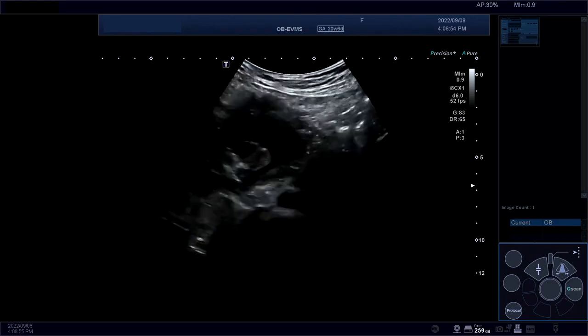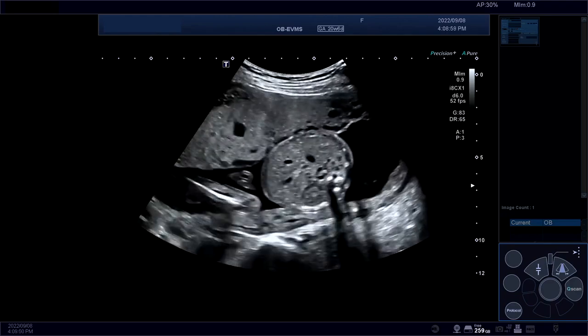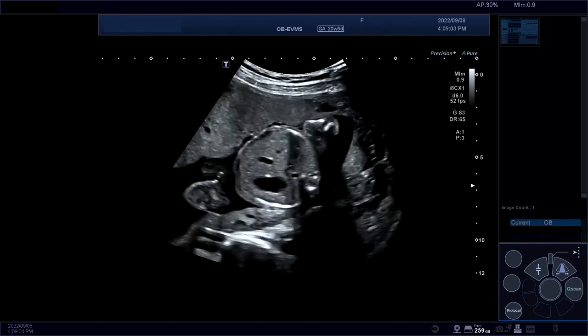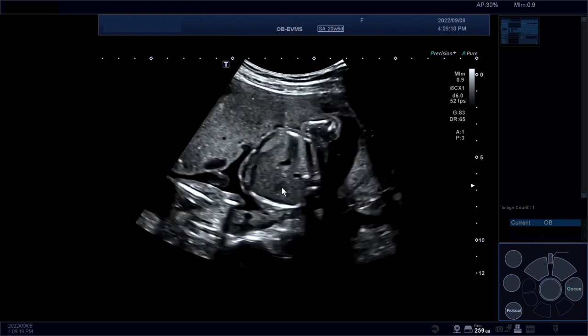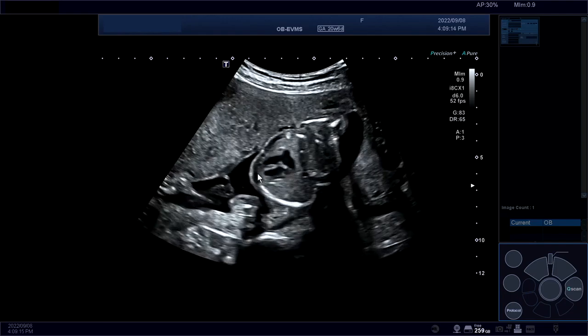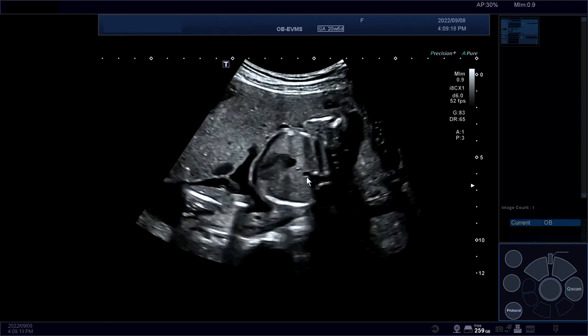So I'll go all the way to the top to make sure the baby is in a longitudinal presentation. So the left side of the fetus would be down. Let me pull an arrow on the screen. Here you go. So the stomach is on the left side. The apex of the heart is on the left side. And I'm going to look at the descending aorta, which is also on the left side.